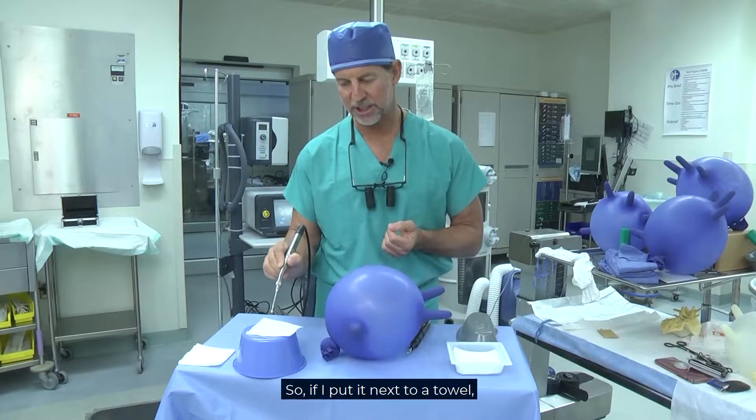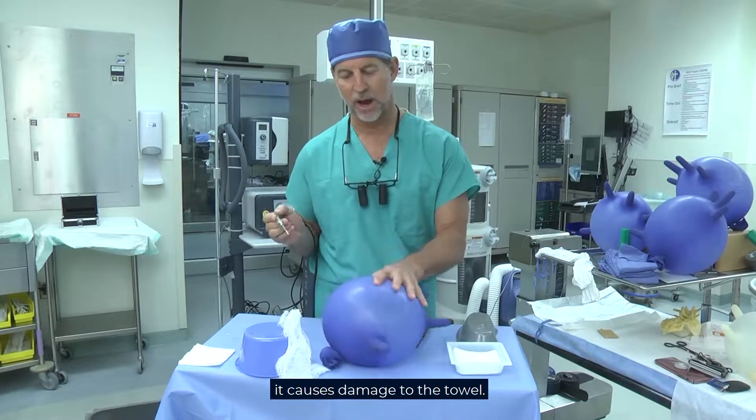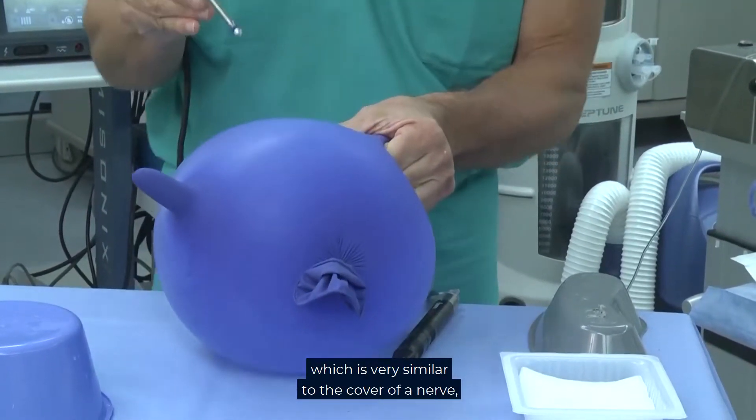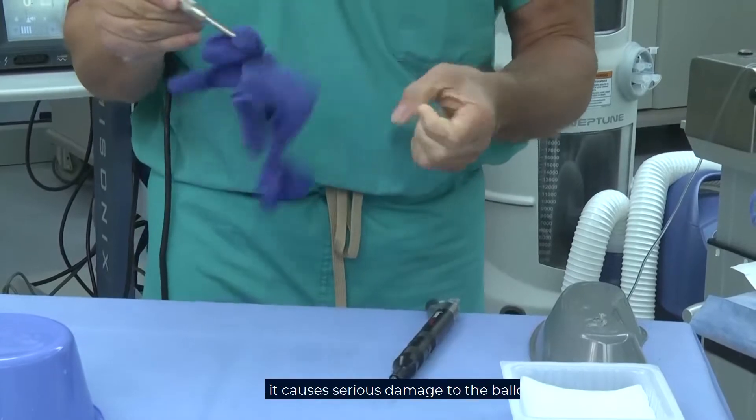So if I put it next to a towel, it causes damage to the towel. When I put it next to a balloon, which is very similar to the cover of a nerve, it causes serious damage to the balloon.